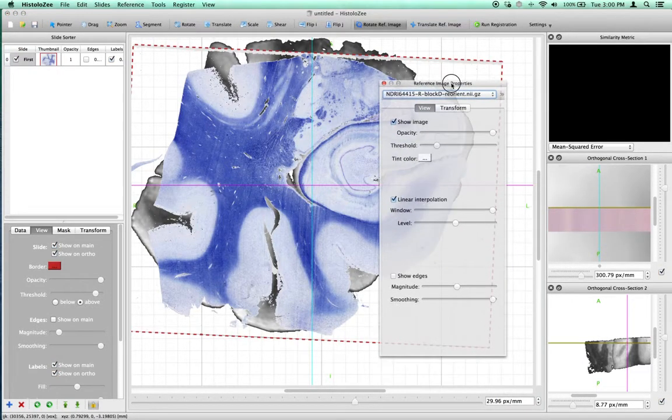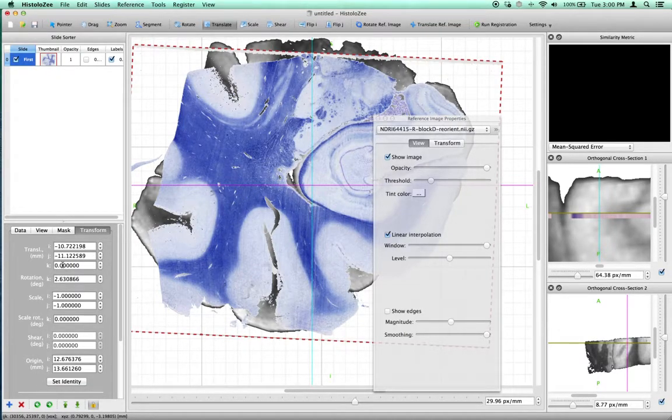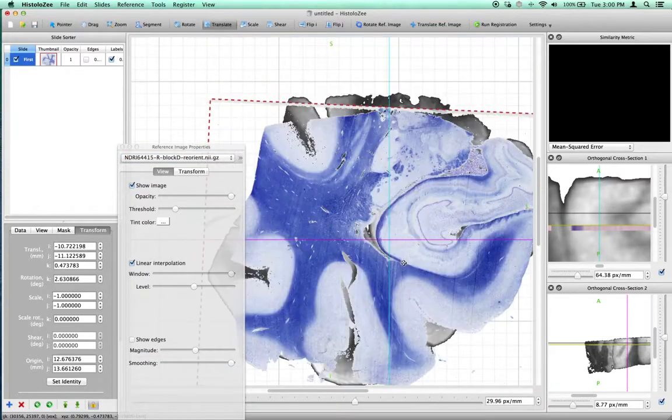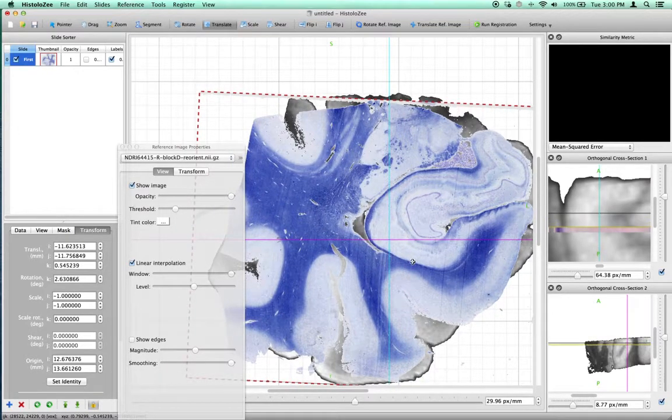So I'm going to zoom out of the window here. Besides in-plane transformations, you can also apply out-of-plane slide transformations in the K direction. That is done by right-clicking and moving the mouse up and down. This dark gray line is the origin of our point system. So this is the K equals 0 origin. So again, we can translate into the plane, out of the plane, and within the plane.